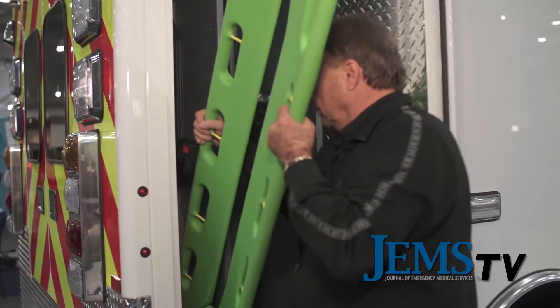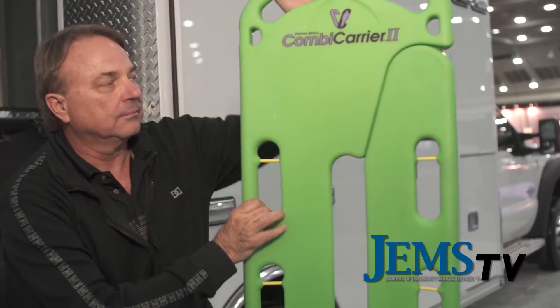What we're showing here is a patient handling system that incorporates the Combi Carrier 2, which is our excellent product for patient handling. We're getting away from spine boards, and we use it in conjunction with one of our Evacusplint products — the newer ones being the Fasplint Full Body and the Fasplint Halfback.